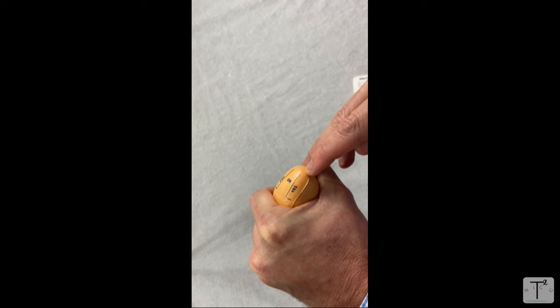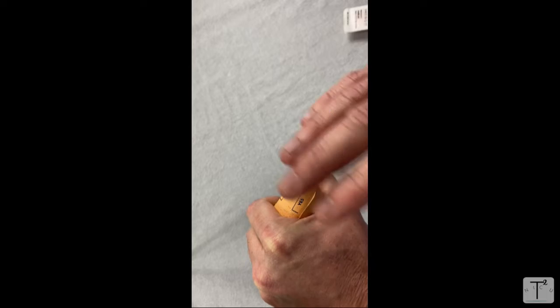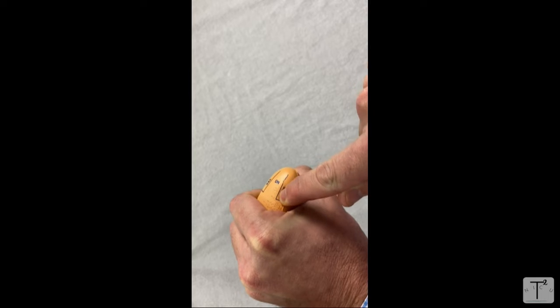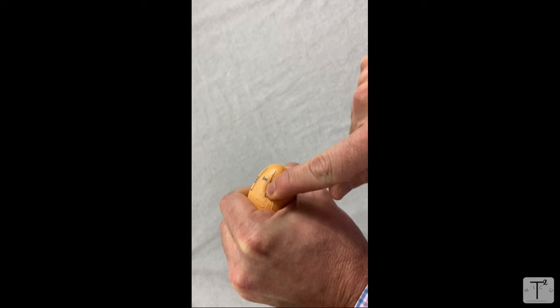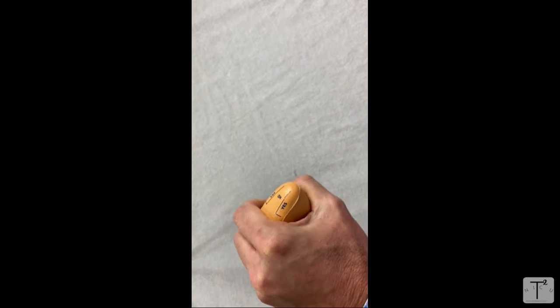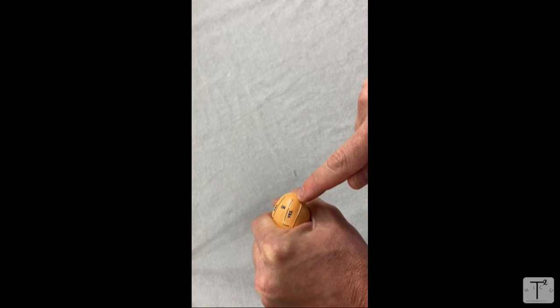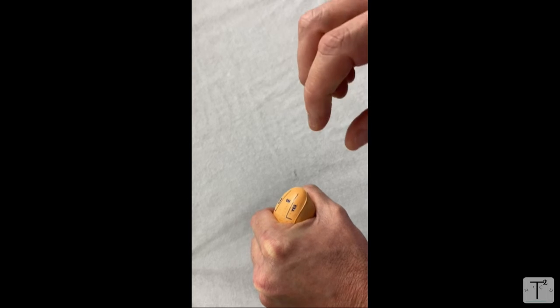After you stick the foot — heel sticks are all different — I tend to recommend that when you activate the lancet, you press in and leave it there after you poke it. Normal people will just poke and let go, but a good recommendation is to poke, leave your lancet there, and then you'll see blood. After you poke, squeeze twice, let go, let your heel refill, then let the drip come down and capture that blood.